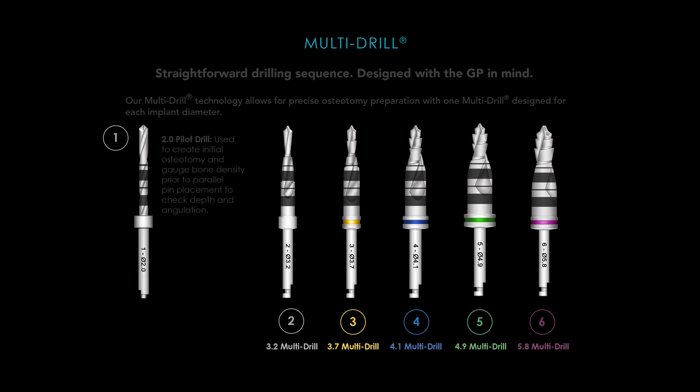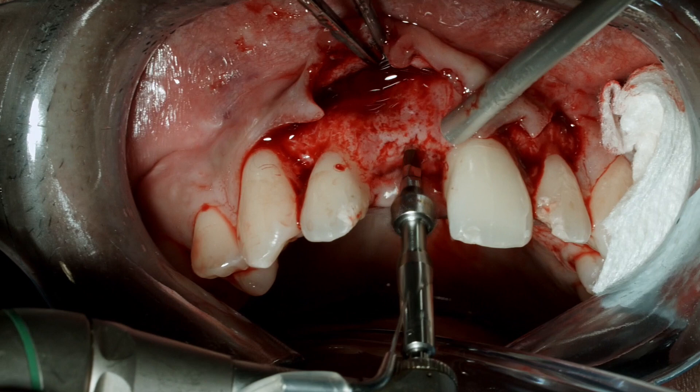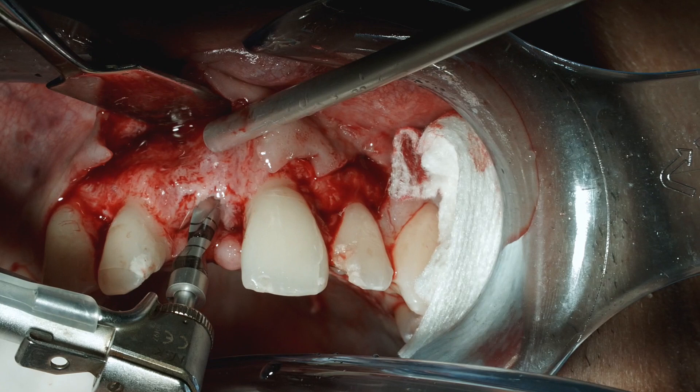This central incisor site is starting with a surgical guide and then going to the two millimeter pilot drill. Again we can see how nicely the drilling technologies cut. Here going to the number two multi-drill — the multi-drills' cutting capacity is excellent; oftentimes I'll actually drill at slower speeds than my typical 600 RPMs.